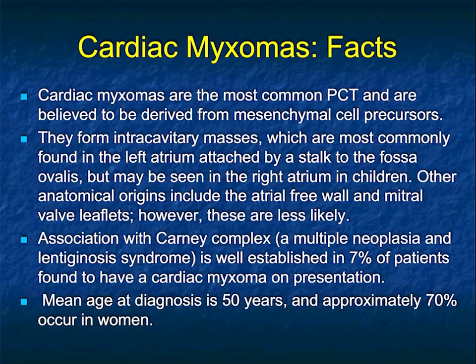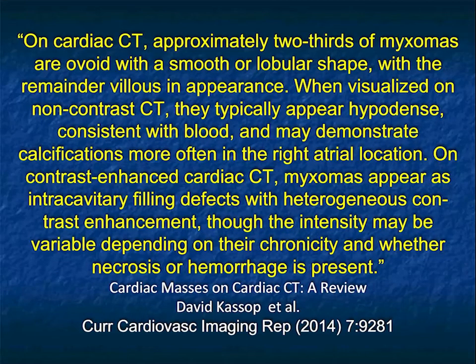They can flip-flop if you were doing a 4D display. Sometimes if you have an ASD, they can go through an ASD. They're associated with Carney syndrome, but that's fairly uncommon. And I mentioned the mean age of diagnosis is 30 to 60 with a mean of about 50, and more than 70% or so occur in women.